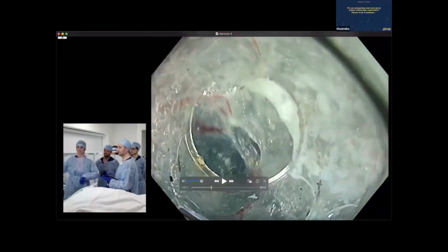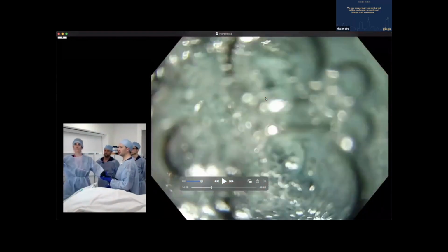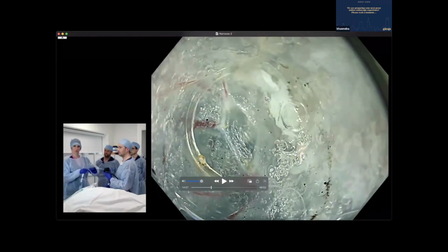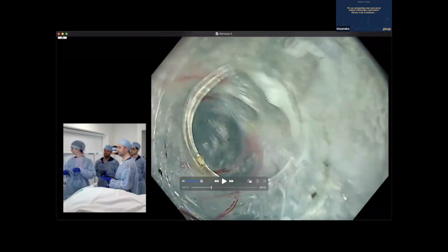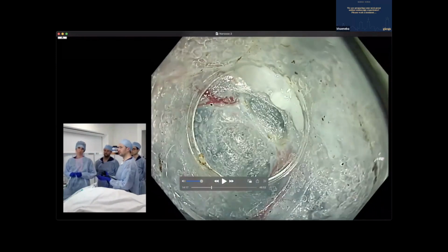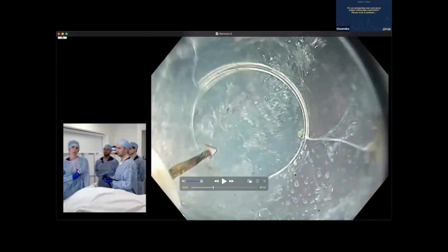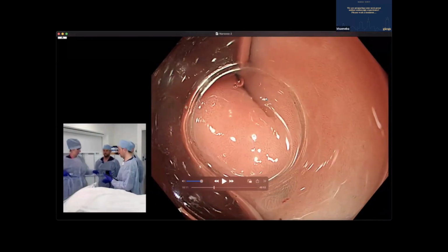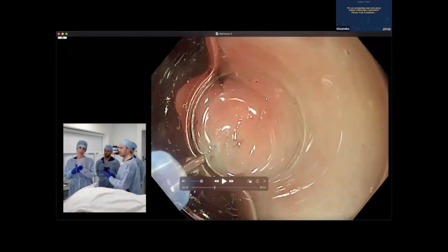And then this was great, wasn't it? One injection of this wasn't enough, really. Can we see this in retrospect? Not really. Not so easy. We had to inject more, and I was afraid of injecting more because of an experience I had before where I injected too much and it all went green. I did a bit more dissection underneath it, I think, because in the end it looked like that. Then a bit more injection of this.